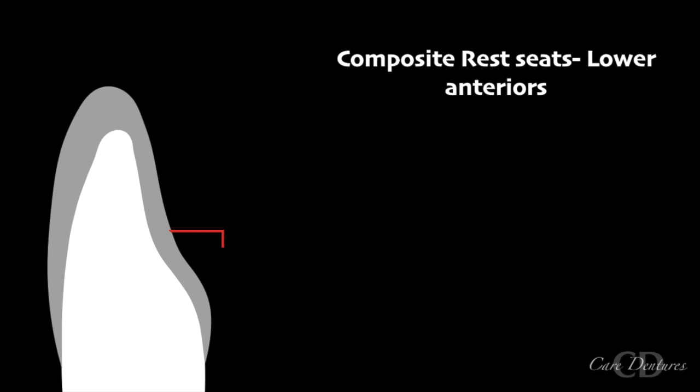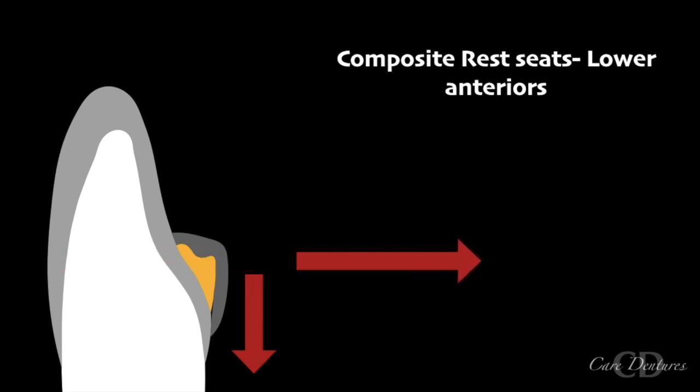With the lower anteriors, the issue arises because of a lack of tooth structure lingually and a more or less ill-defined cingula on the incisors and canines alike. A modification which may be adopted in such cases is building up the lingual surface with some composite, whereby the metal extension would then wrap in like a hook and direct the forces along the long axis of the anterior tooth and avoid sinking of the denture. Not only this, but also the distal movement of the free end saddle can be prevented with this feature.